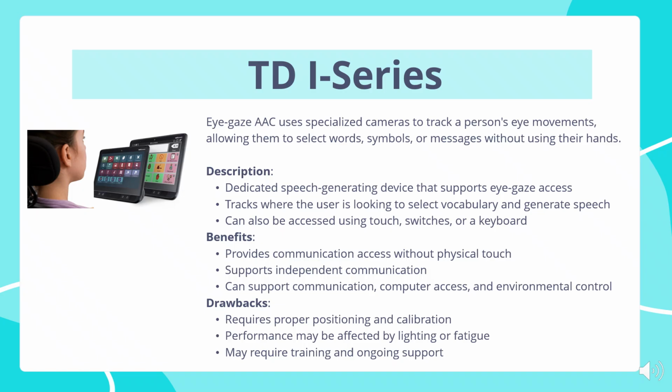Because eye gaze systems rely on accurate eye tracking, they require proper positioning and calibration. Performance may also be affected by different lighting conditions or fatigue, and users also may benefit from training and ongoing support.